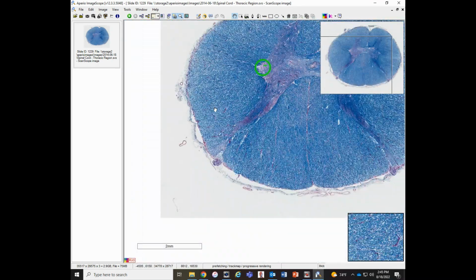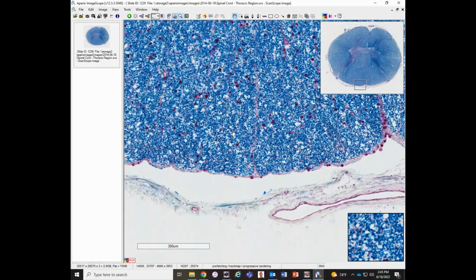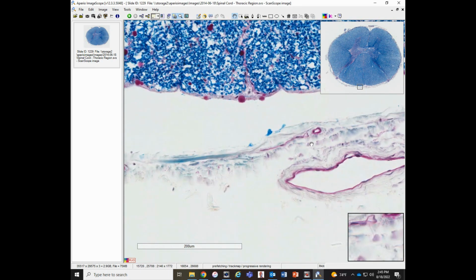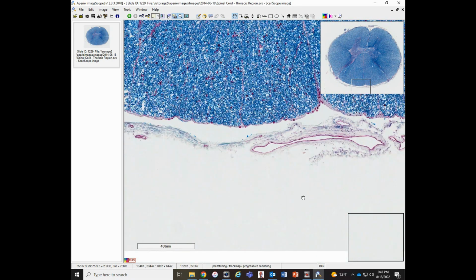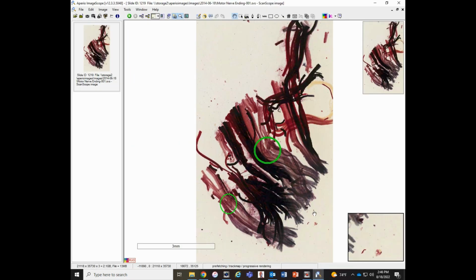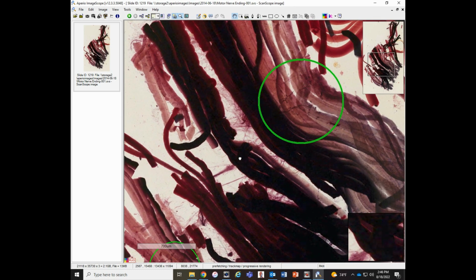All right. Just before we're done here is a quick little fun part of the tour. We've got the outer layer here, the pia mater. We've got the cobwebby arachnoid mater with the vessels going to the spinal cord, and we don't have the dura mater, but it would be another outer, thicker layer right there. And the nervous system to the muscles that it's innervating.